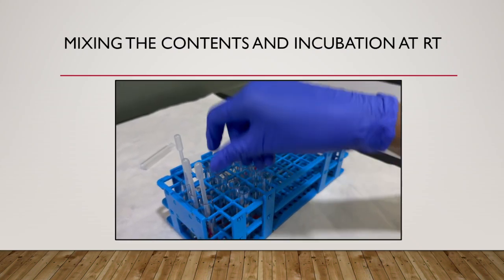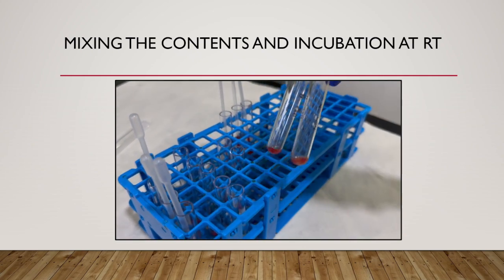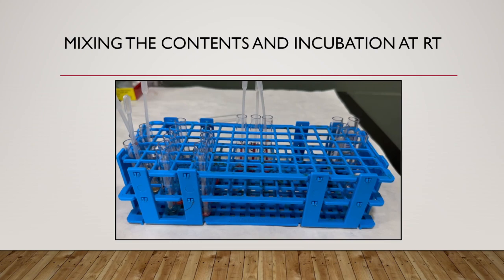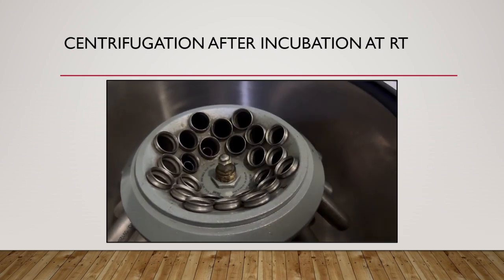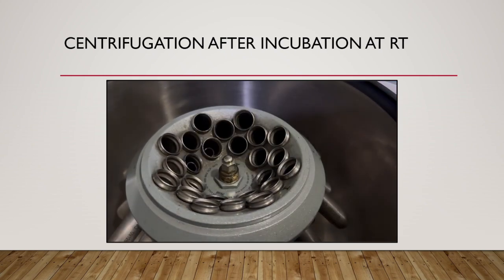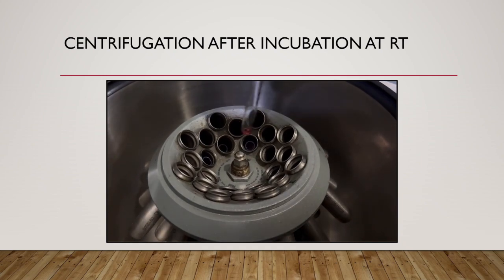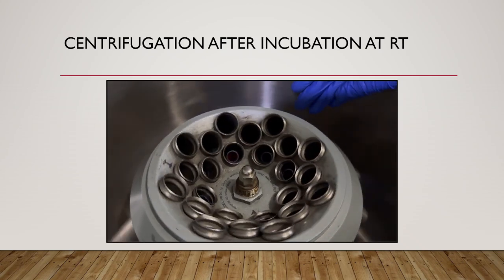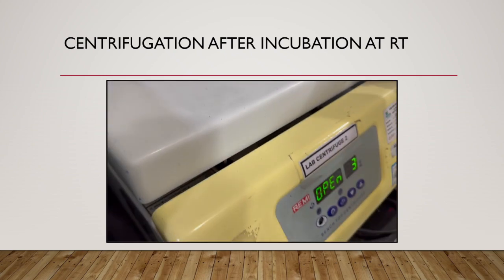Now we are going to gently shake the tubes and mix the contents of both forward and reverse grouping. We will ensure that all the contents are mixed very well, and after that we are going to incubate the tubes for 30 minutes at room temperature. After incubation, we are transferring all the tubes for centrifugation. The tubes should be placed properly in the appropriate slots. We must also ensure that the weight is balanced in the corresponding opposite slots to get a proper result. We are rotating the rotor to ensure that the weight is balanced properly, and after that the centrifugation has to be done as per the standard operating protocol of your institution.